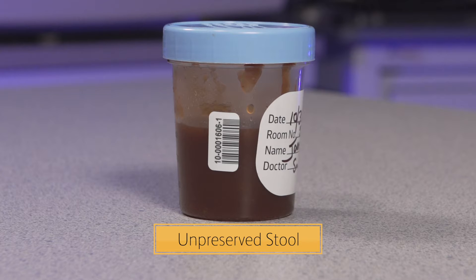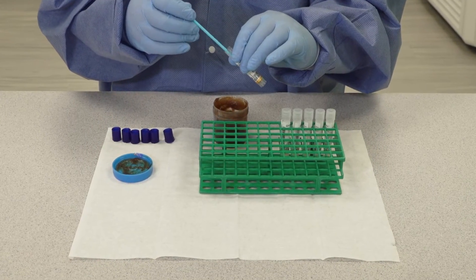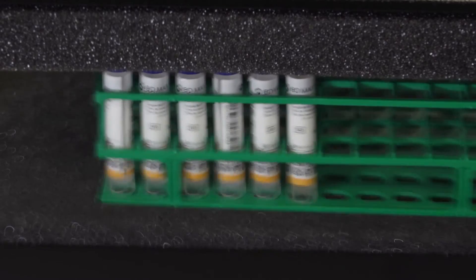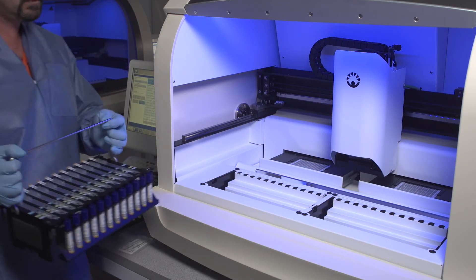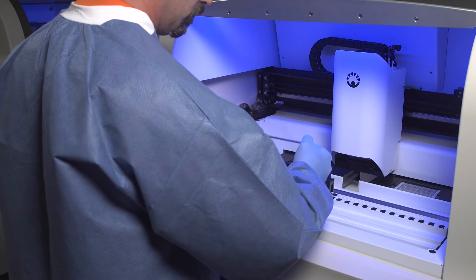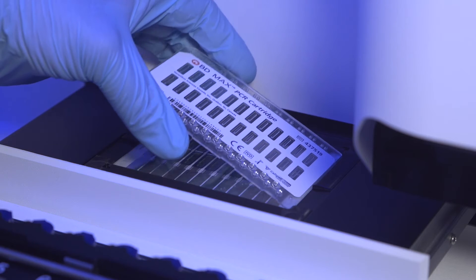The BD MAX C. diff assay requires stool to be collected from patients and transported to the laboratory as an unpreserved specimen. The specimen is inoculated into a sample buffer tube and then vortexed and transferred to the BD MAX system rack. The BD MAX system is loaded with the BD MAX racks containing the prepared sample buffer tubes and assembled unitized reagent strips and the PCR cartridge.